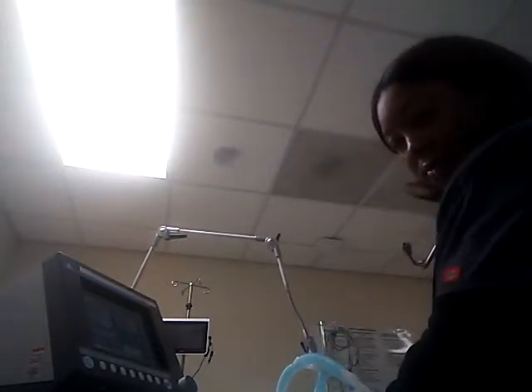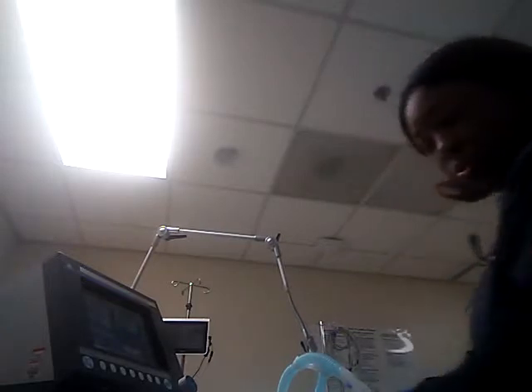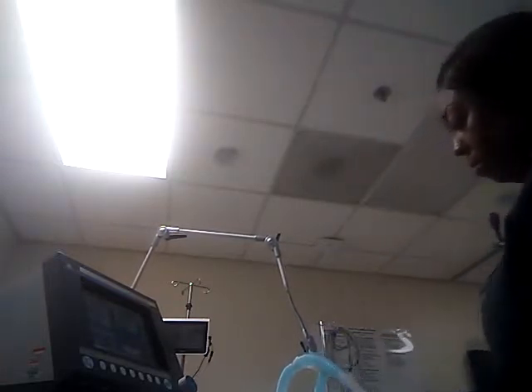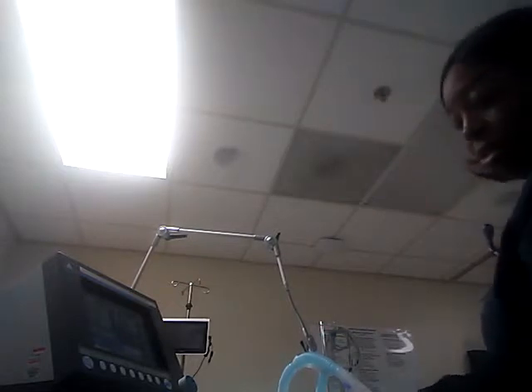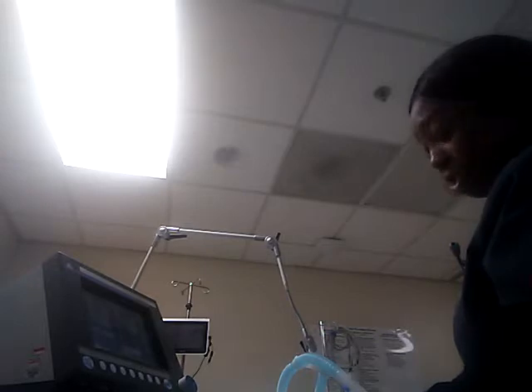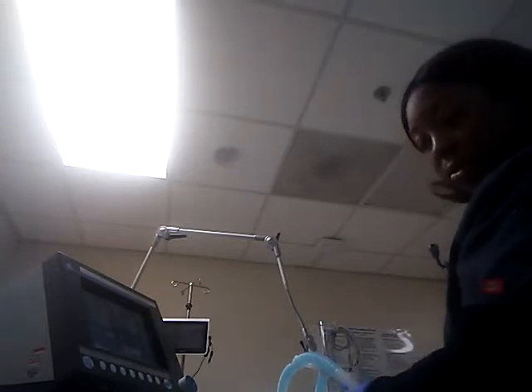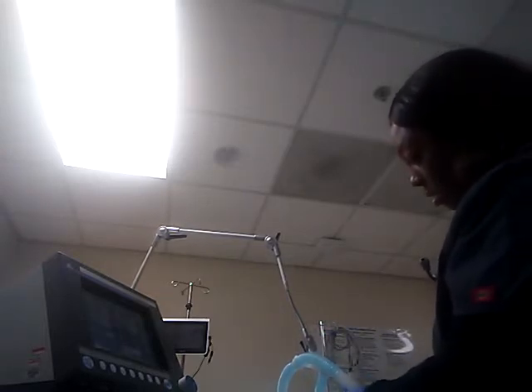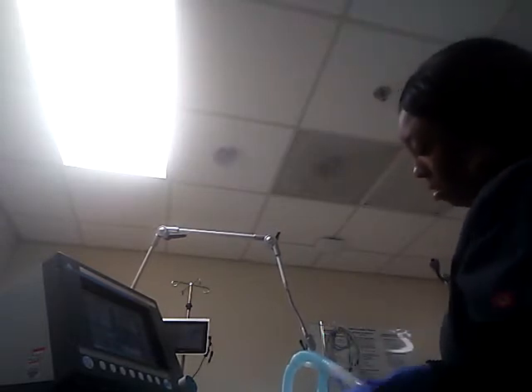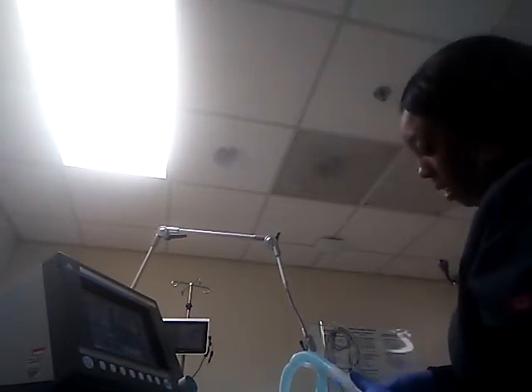That alarm is going off because I kind of unhooked and I didn't mean to, saying low inspiratory pressure. Okay, we're going to keep it on aerosol until we get done with the treatment. Once we get done with the treatment, we are going to change it back to the humidifier. I'm going to disconnect our neb down there. We're going to put our adapter cover back on this spot.